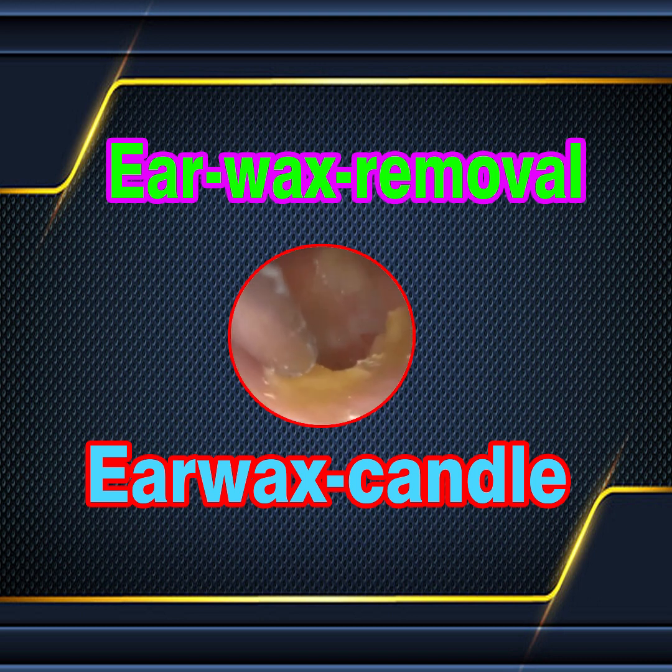So the purpose of removing this dead skin is just to reveal the healthier underlying skin, and it's probably unlikely to come out by itself. This is really debris. And when this patient begins to use the topical antibiotics, it can penetrate and make contact with the surface of the epidermis layer of the ear canal.